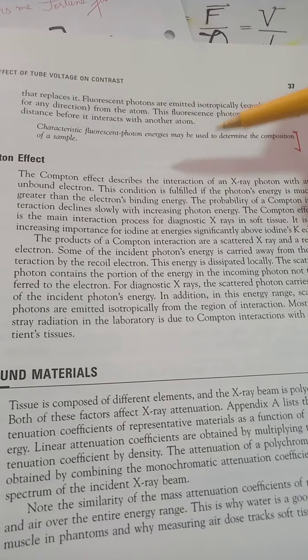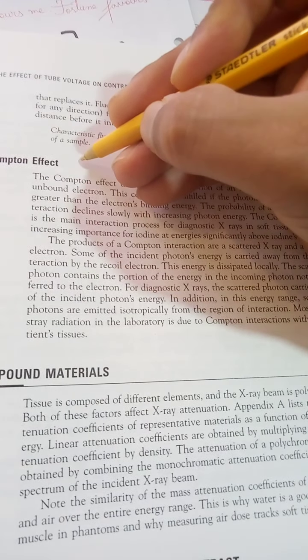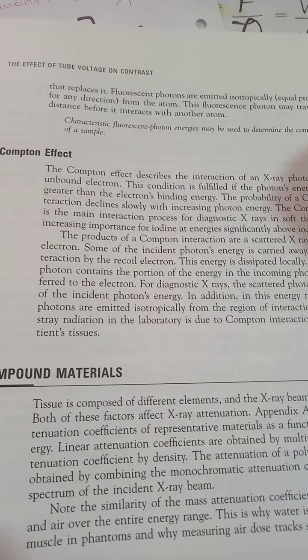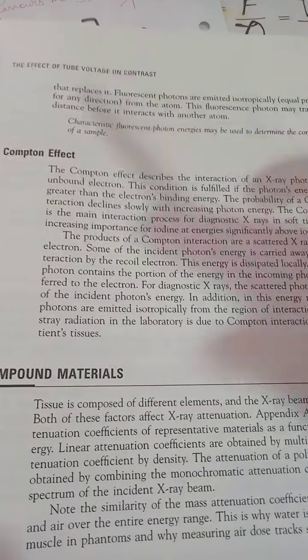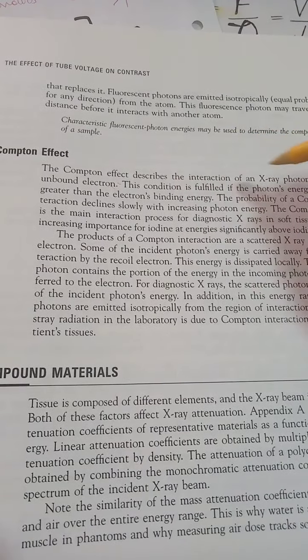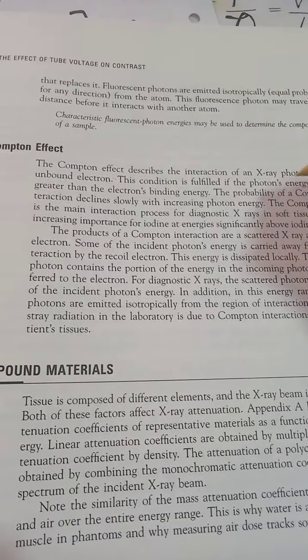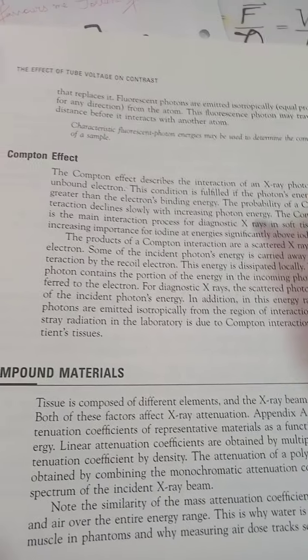The Compton effect describes, so basically there's a formula for Compton scattering as well, which we will see soon. The Compton effect describes the interaction of an X-ray photon with an unbound electron at an angle. It should have mentioned at an angle. It's an angular interaction. The condition is fulfilled if the photon's energy is much greater than the electron's binding energy. The probability of a Compton interaction declines slowly with increasing photon energy.